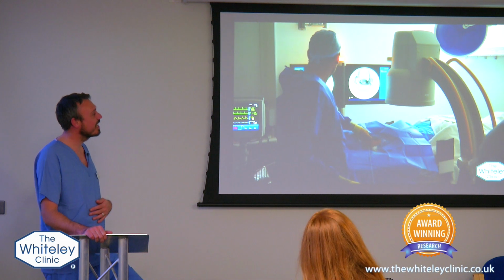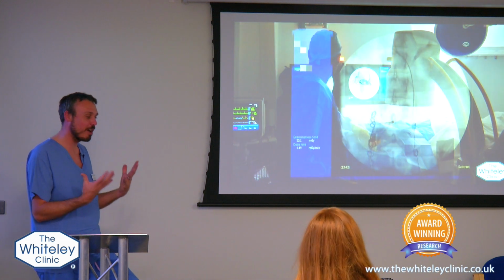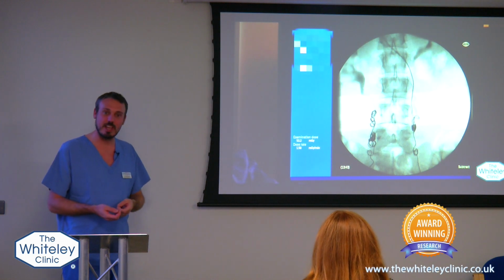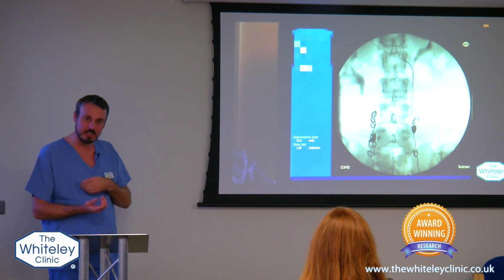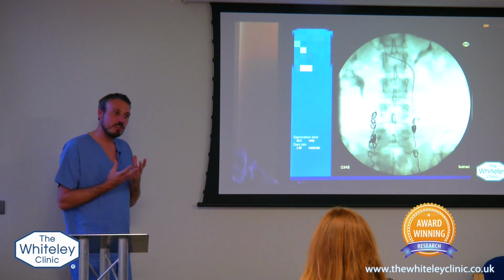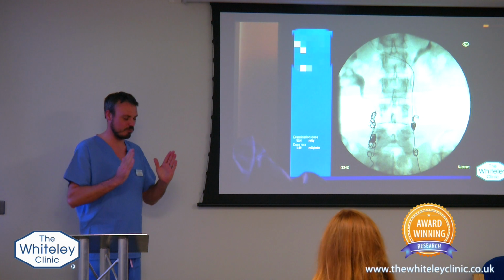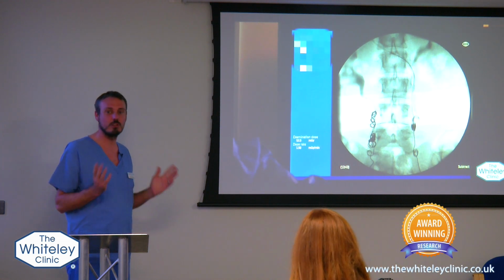And when you come to the clinic, I can probably show you one of these coils. They're not how you imagine. They're almost just like a piece of hair plucked from your head. They're that thin, they're that flimsy. They've got no significant structure and rigidity to them. You've got this impression of a really rigid piece of metal, but it's not at all.